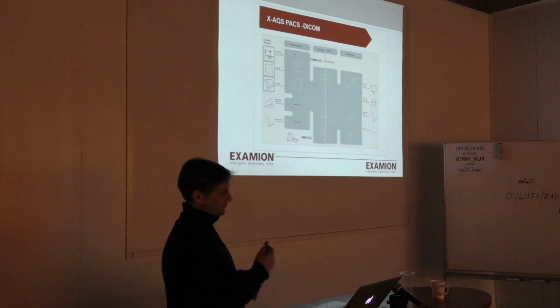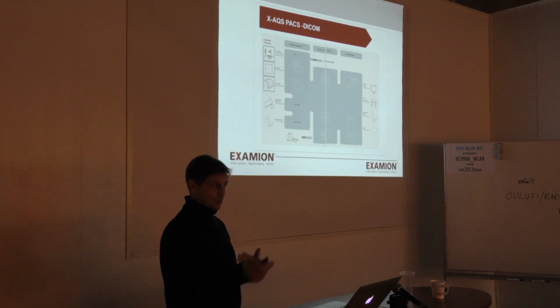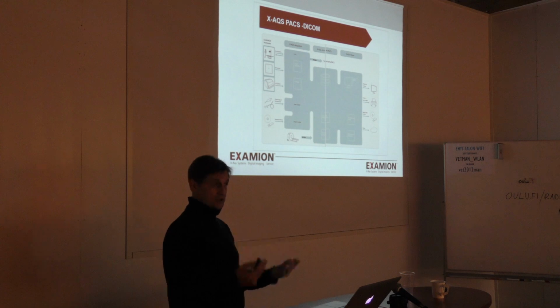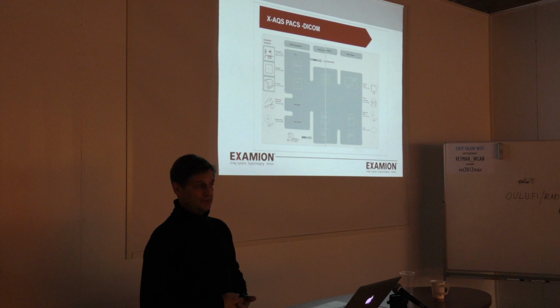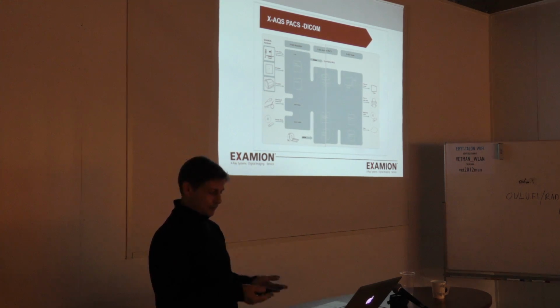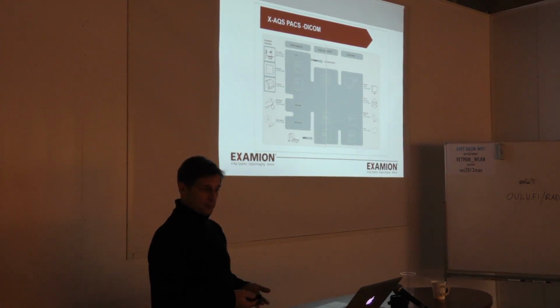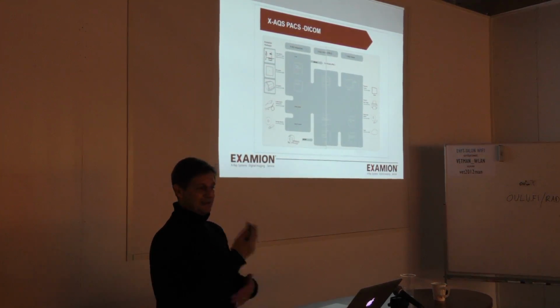So in the last 5 years the veterinary world has gone a little more in that direction. Also important are people from the universities, or larger, more specialized clinics, which work as referrals. For them it's very important to have the images ready, so they can in a very easy way open up the images, get the full data with the images, view them, make a direct report which is not too complicated, and automatically send it back.